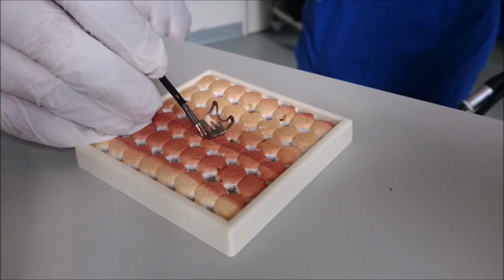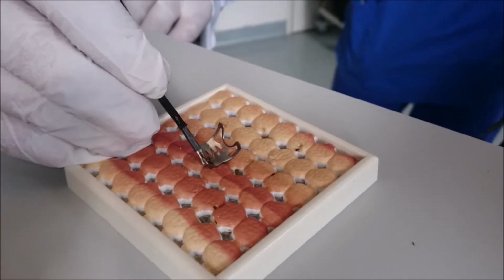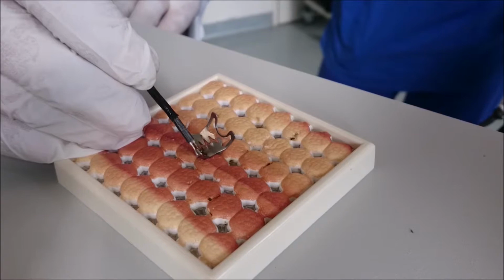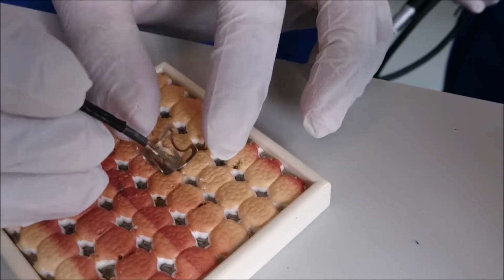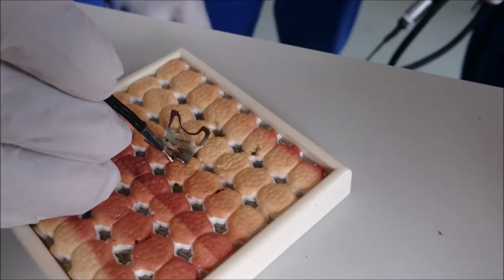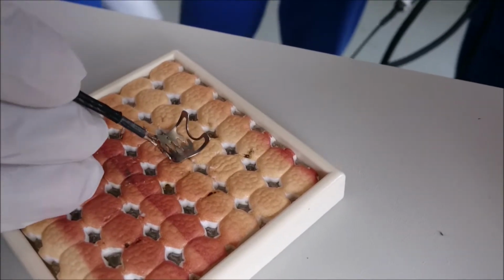Demonstration of the remove cutter on a model. When there is constant contact between the clip and the device, an acoustic signal sounds. The cutting process can now be triggered by activating the foot switch once. This creates a direct current impulse that causes the material to melt. Ideally, this will happen at the thin spring arches on the clip.